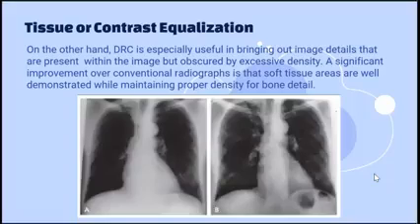The DRC developed by Fujifilm has 20 pre-installed software filters, like the different types of filters you see on Instagram. We also have filters here so that the image will be of much better quality. And a DRE function sets the level of enhancement to be applied, or the strength of the filter, customizing the final grayscale to the anatomy to be demonstrated.